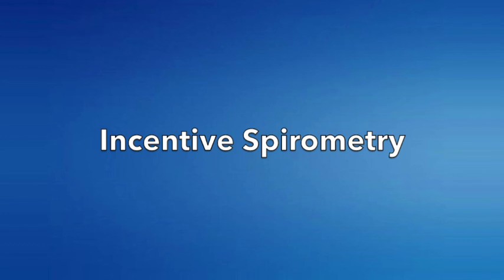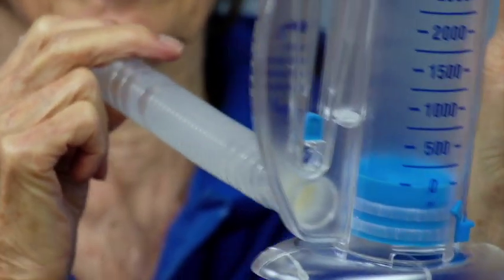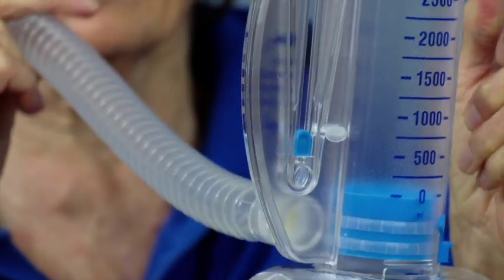Incentive spirometry can help you expand your lungs and breathe deeply. Before you begin, hold the incentive spirometer by the handle and sit up straight. Extend the corrugated tube and hold the device level with your face.